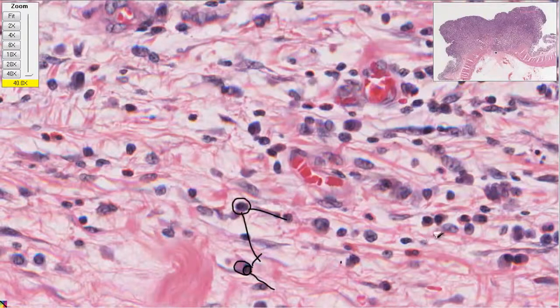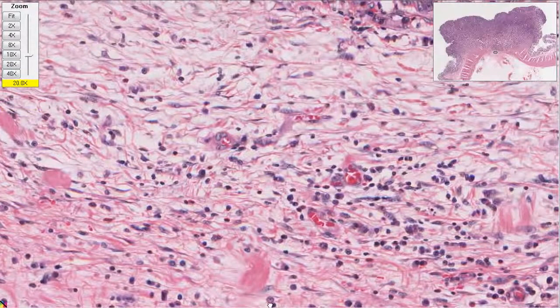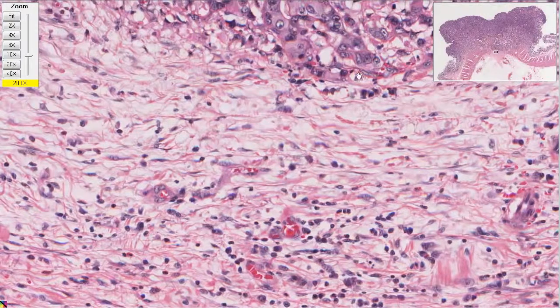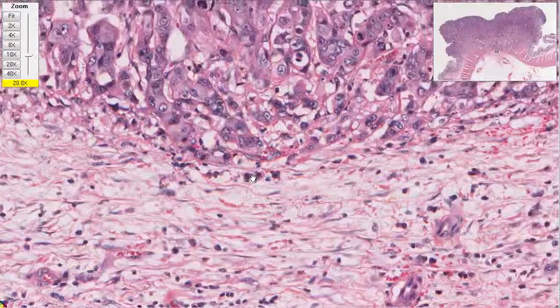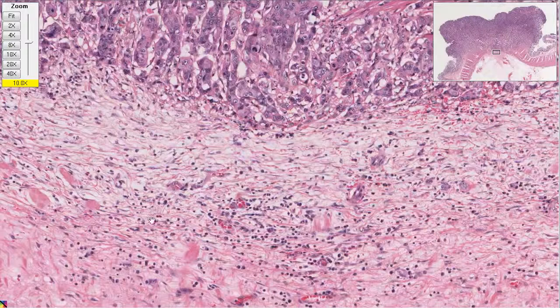So when looking through here, at this depth, which ones are cancerous? Let me get over here and come out just a little bit. These are all inflammation. The nearest cancer cells, where I could bet the farm, are these guys up here. On this view it becomes more obvious. They definitely look different. Then when you come out here, you can see there's the cancer. This is the body's reaction to the cancer right there, at the deepest zone. And there are therapies based on trying to get more of this immune response. That's amazing. Very cool.